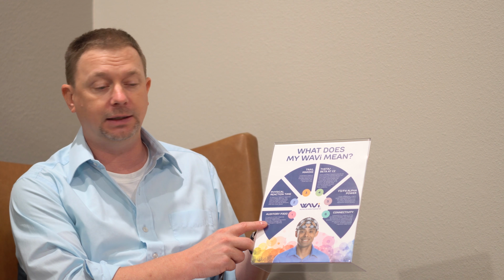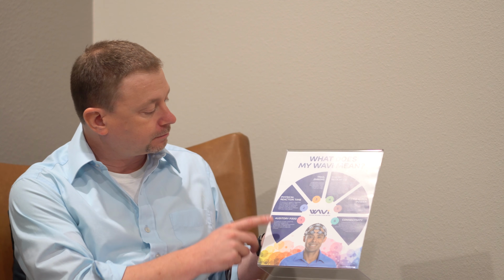those other beeps. And when you hear that, your brain registers an extra wave. And that's called the P300 because it's supposed to happen at about 300 milliseconds. So that's what this test is. It's a very good measure of concussion and TBI and all kinds of different problems, from PTSD to mental decline.